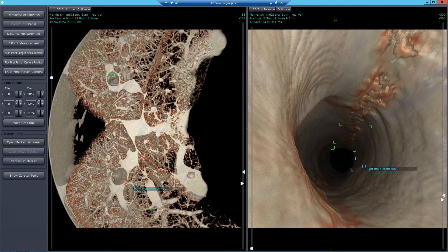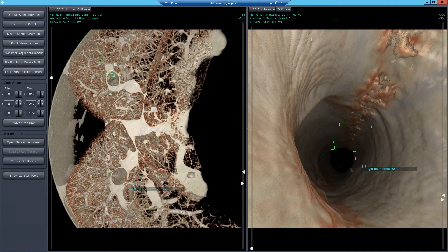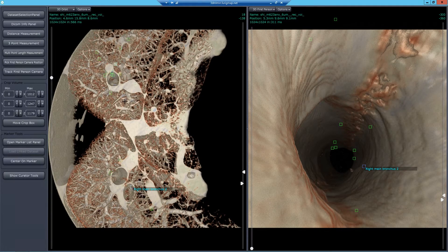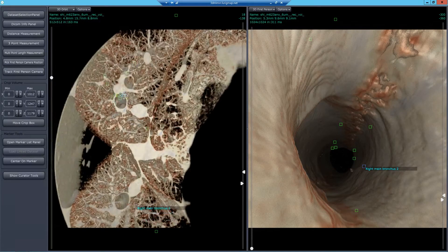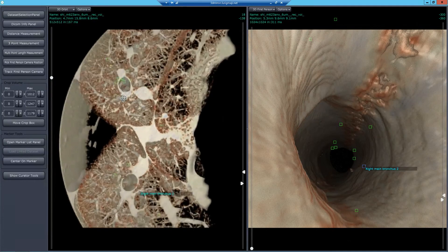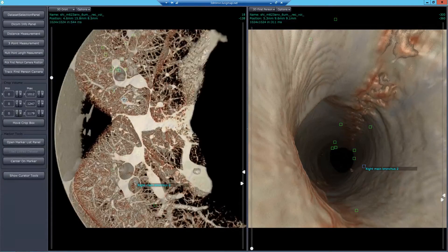There are a number of buttons and tools available in whatever viewpoint you are working in. We have the name of the data set, X, Y, and Z coordinates. We see the size of the particular frame and then how long it took to render. When we move anything, we see changes in those numbers.